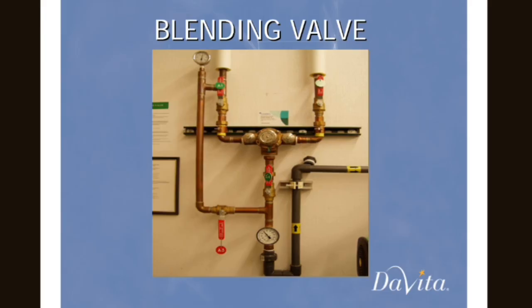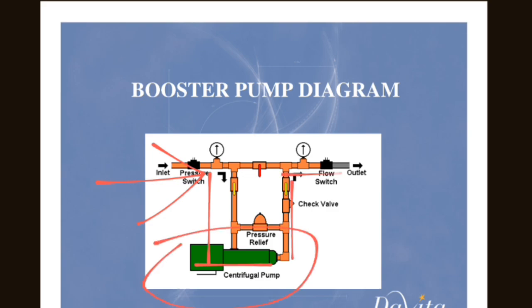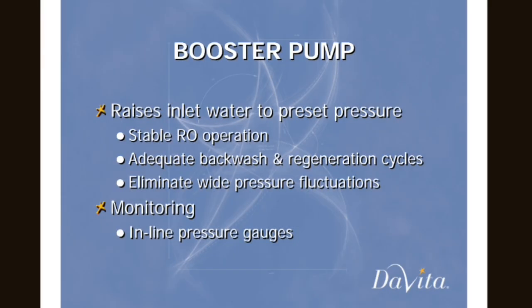Here is a photo of a temperature blending valve. After that temperature blending valve, water passes to a pump called the booster pump. So what is the function of that booster pump?